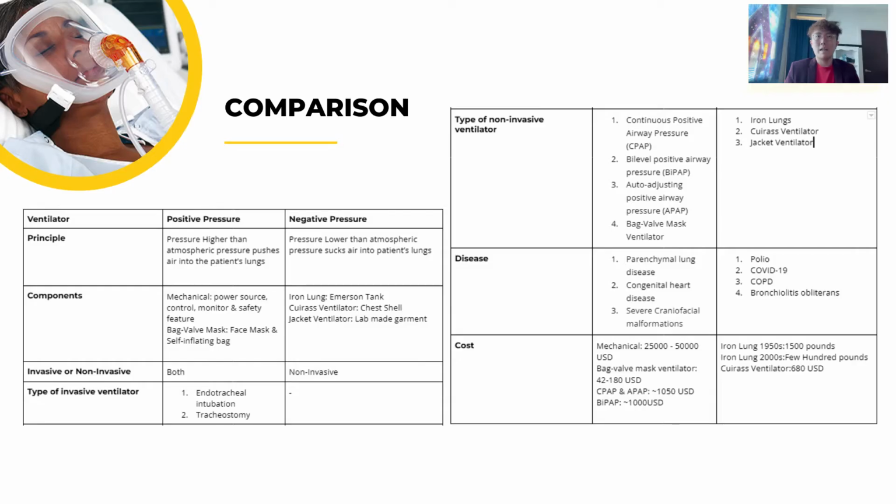Thank you. Let's take some time to look at the comparison table below. The points I would love to highlight are the mechanism, the presence of invasive or non-invasive method, and also the disease it is used to treat.